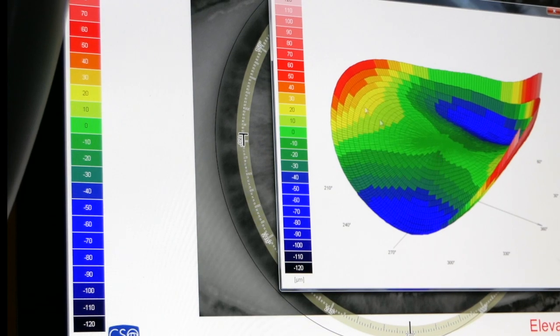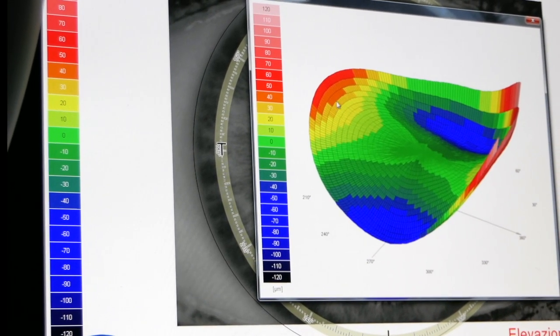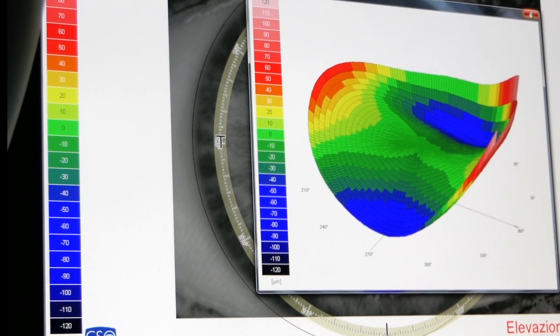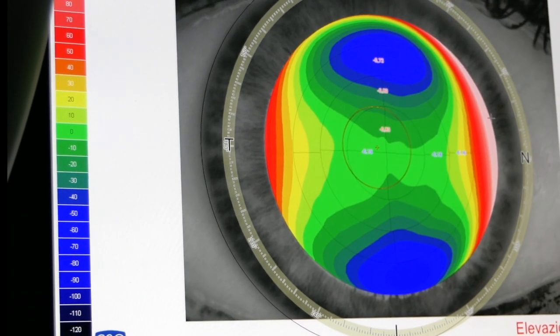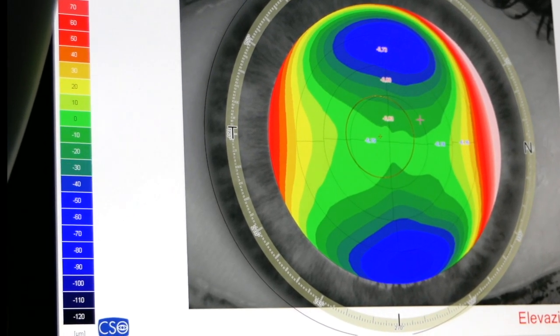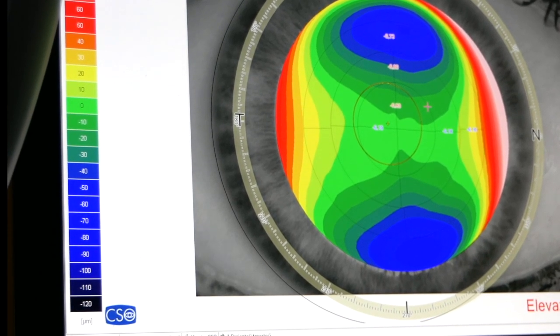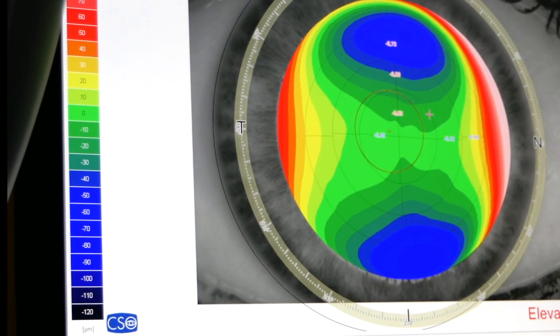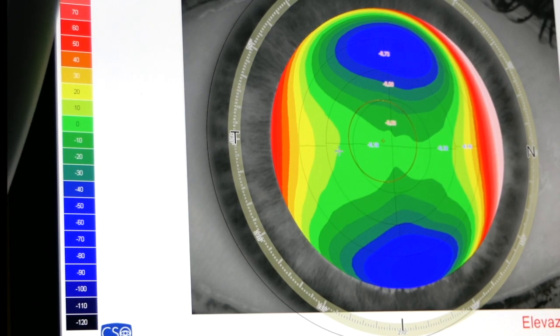The blue ones in which the cornea is further back than the ideal cornea, and the red ones in which the cornea is more advanced than the ideal one. This is artificial because in reality, it is not so. There is no ideal cornea.